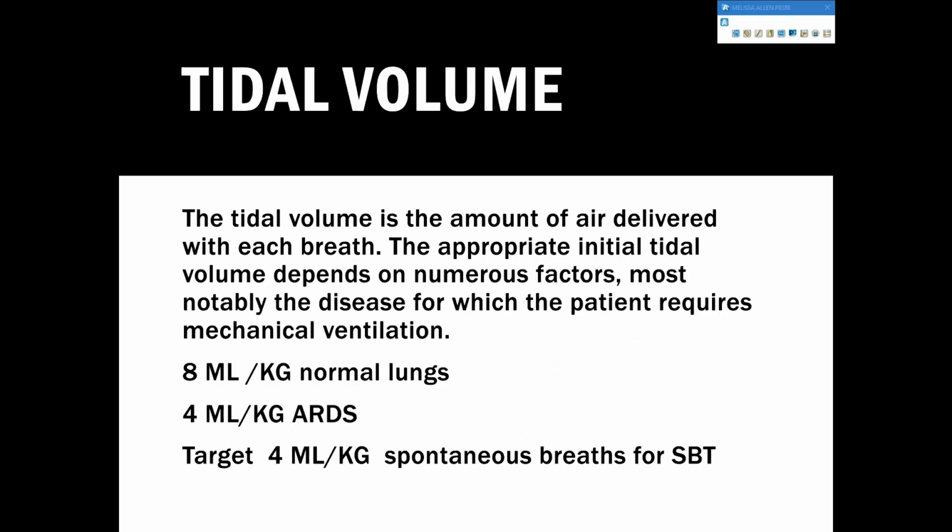All right, let's talk about tidal volume. Now, it is really important to use ideal body weight, because people can be 200, 300 pounds overweight, so we're not going to give them a crazy tidal volume based on their actual weight. But you can get a basic idea with their real weight. I did not include the ideal body weight formula. I know it's posted somewhere in the department. The one that we use in respiratory is very different from the one they use at a personal trainer or something like that.